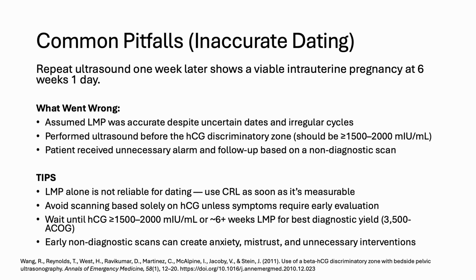So the LMP alone is not reliable for dating. I mean, how many times do people just make up an LMP, or they aren't really writing it down, so they really have no idea. So just be careful about using the LMP to make a diagnosis. Avoid scanning based solely on the HCG unless symptoms require early evaluation.